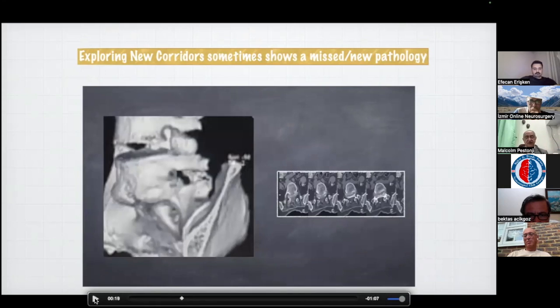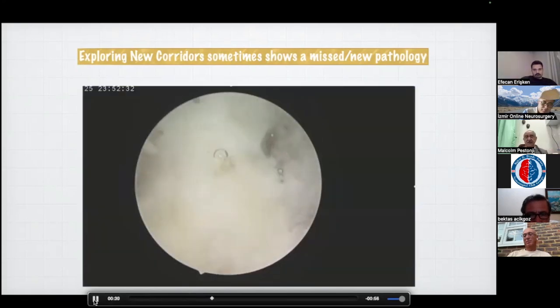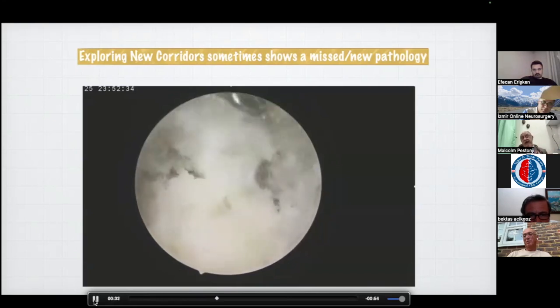So let's do a CT. CT again shows me an open foramen and a huge fusion mass in front. And you see here, left foramen open. Nothing there. As a matter of fact, super wide laminectomy, which caused instability, which went into fusion 10 years ago. And now she's come to me with back pain, sciatic pain. You can see the fusion everywhere. So what do? I do a para-UBE.